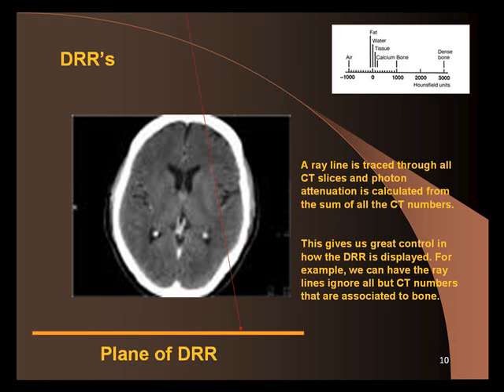Now, DRRs. DRRs are digitally reconstructed radiographs. That's what DRR stands for. And DRRs are a byproduct of a CT scan.